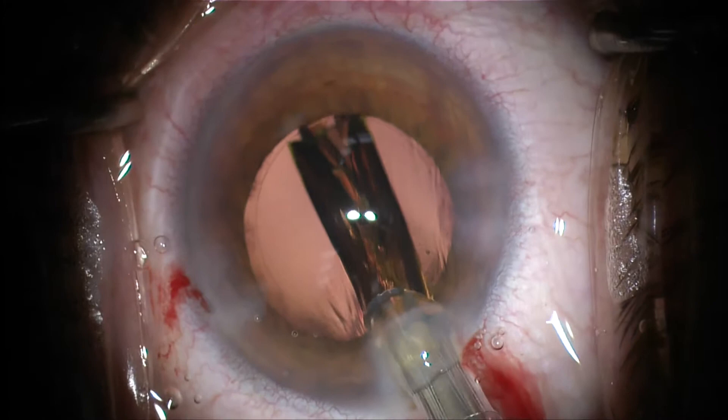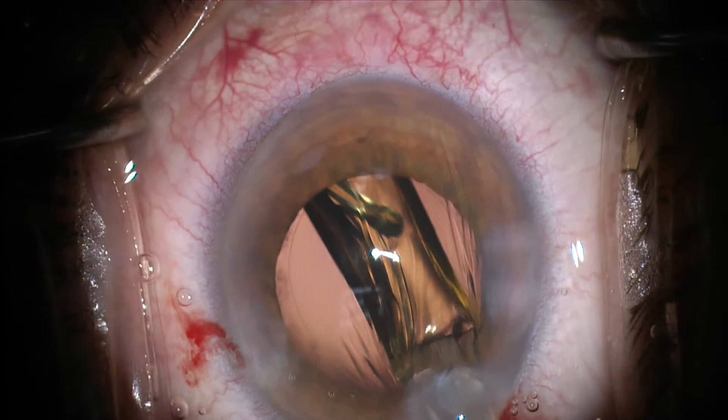And this is a multifocal lens. The technique is the same for monofocal lenses. And once the lens is in the bag, we remove the viscoelastic so we don't end up with raised pressure.